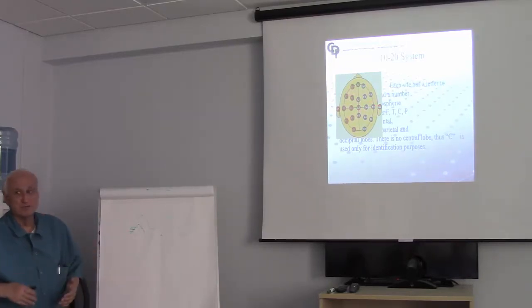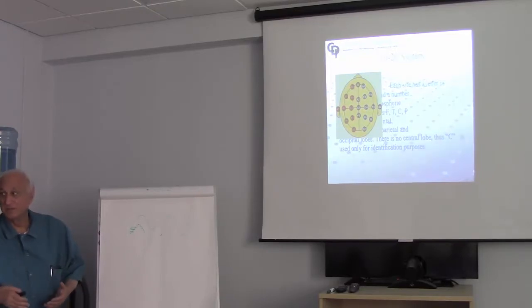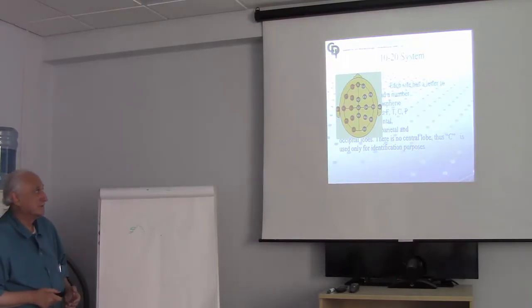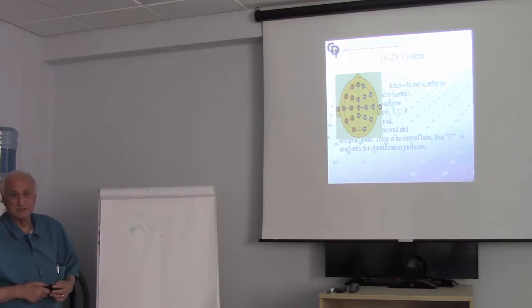So it's a common nomenclature, and it's important because when you discuss what you're going to do, you've got to have a way of discussing it in a common language, just as you do when you talk about diagnostic data. You need to have a common language to discuss it. So if you're not familiar with it, you should spend some time and familiarize yourself with the 10-20 system. But I think everybody here probably is.